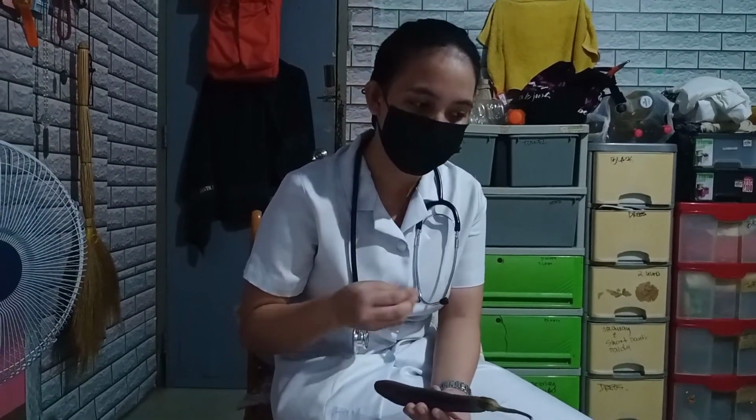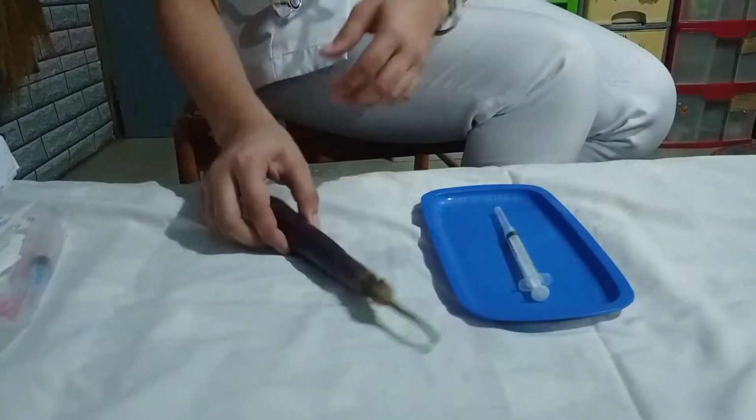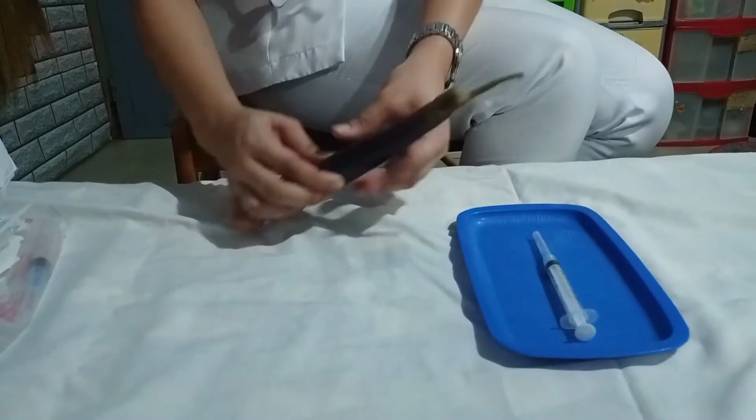First, I'm going to locate a site where I could inject the intramuscular area, and I'm going to gently palpate the area using my fingers to check if it is tender or if there is any inflammation. The rationale for that is that stimulation of the peripheral nerves can minimize the pain of the injection and of the needle being inserted into the patient.